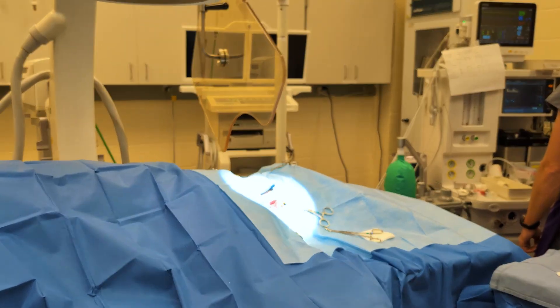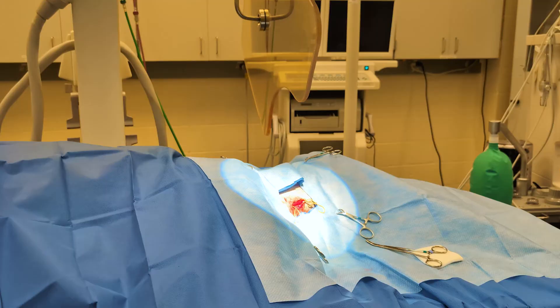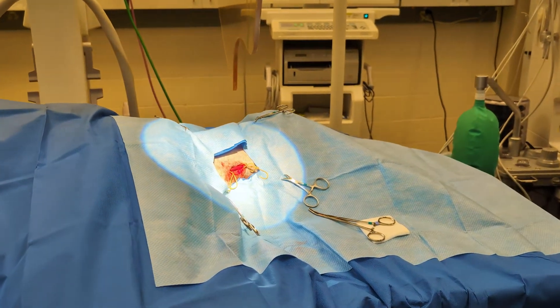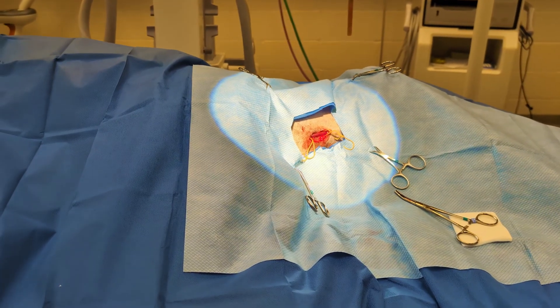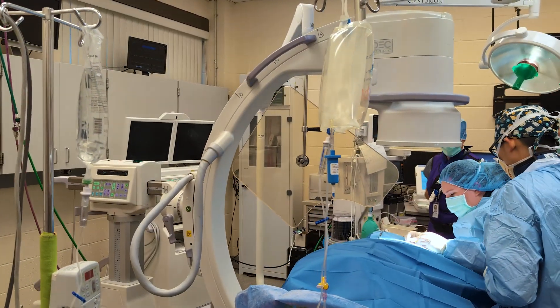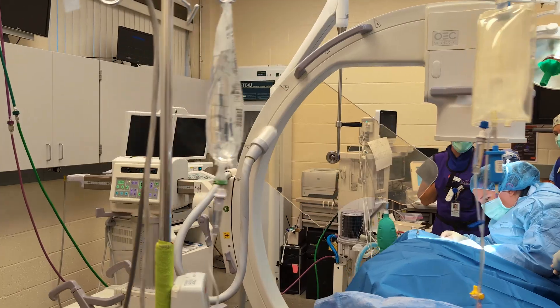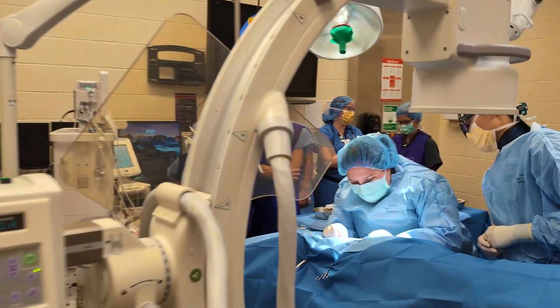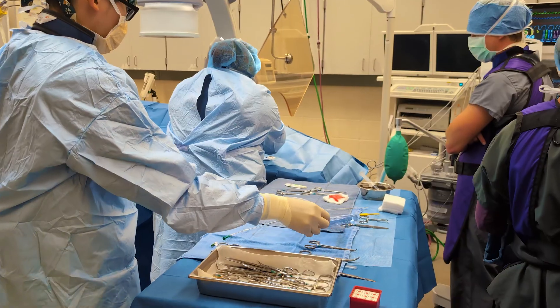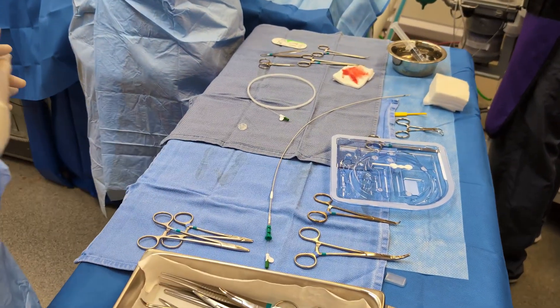We use vascular loops to be able to intermittently hold off pressure on either the head side or the body side of the jugular vein. We then use scissors to open the jugular vein so that we can feed the permanent pacemaker lead down inside the heart.